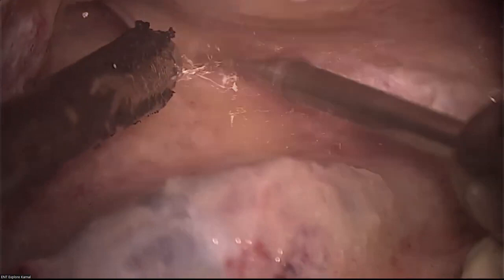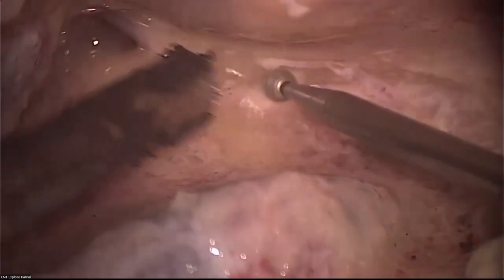Boss, you are using a 2 mm burr now? Yes, this is a 2 mm burr now.